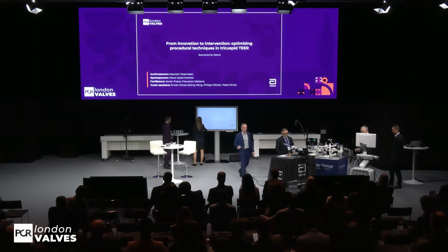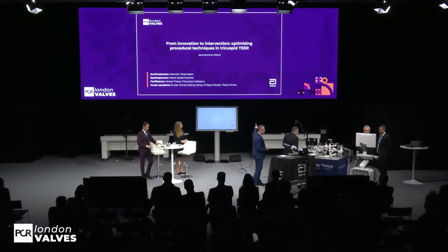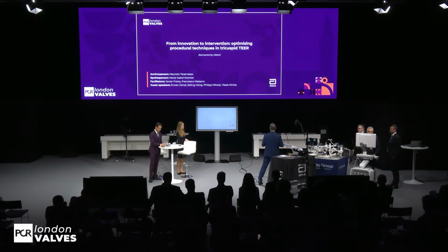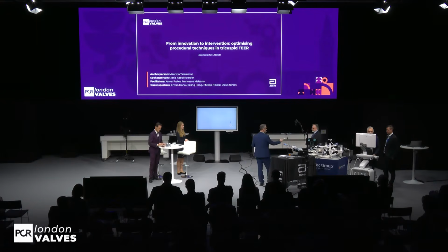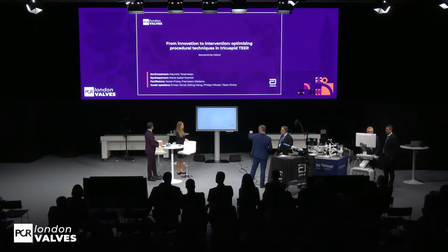It's here, the pencil of the smart screen. So basically, can we see the anatomy? Can we just put the screen there? Okay. Can we show it on the big screen?